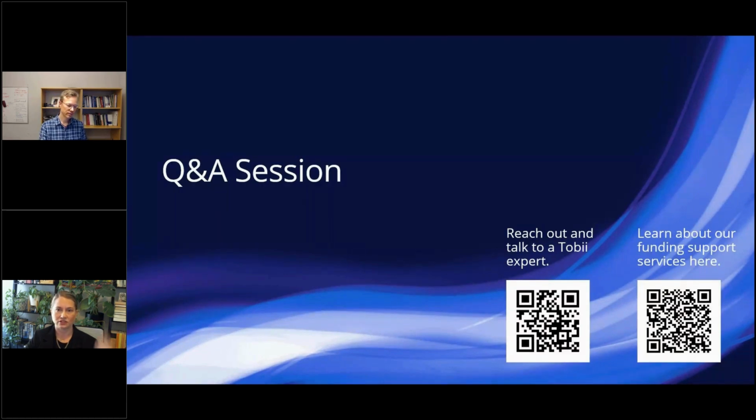Yeah, so you can check that out as well. There are a couple other questions on here about some of our other eye trackers. At this point, with the Glasses 3, we do not have eye openness data, so this blink algorithm would not be available for that, unfortunately. And there's a question about the 4C eye tracker, which also does not have eye openness data.